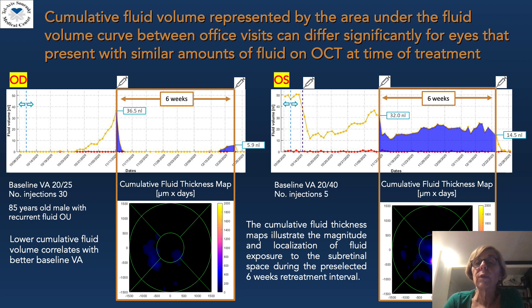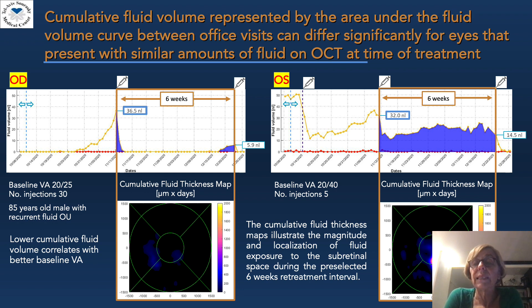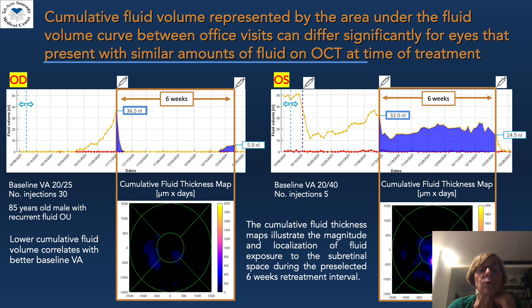We are introducing the concept of cumulative fluid volume, represented by the area under the fluid volume curve between office visits. In this bilateral case, we see that the cumulative fluid volume can differ significantly for eyes that present with a similar amount of fluid on OCT at the time of treatment. The cumulative fluid thickness map illustrates the magnitude and localization of the fluid exposure to the sub-retinal space during the pre-selected six-week re-treatment interval. Of note, the lower cumulative fluid volume in the right eye correlates with better outcomes.